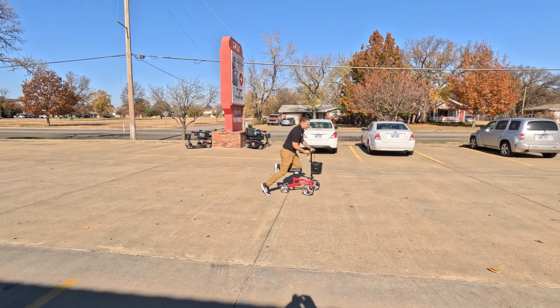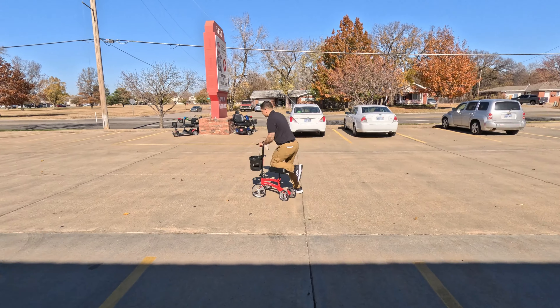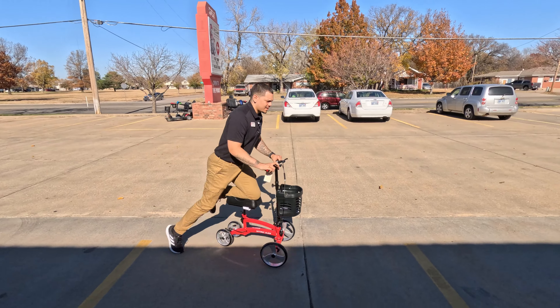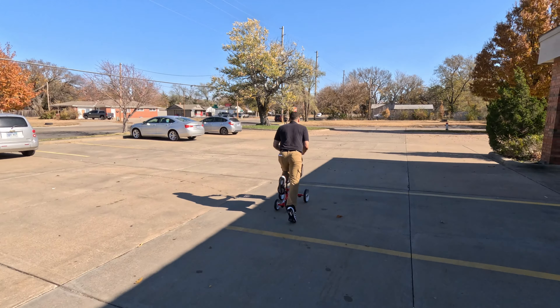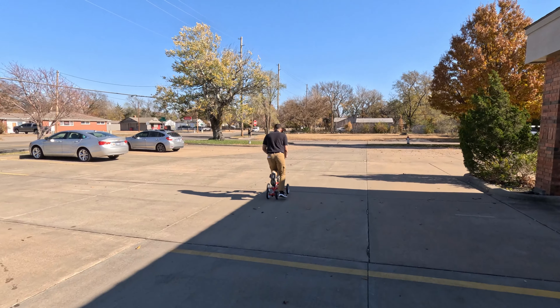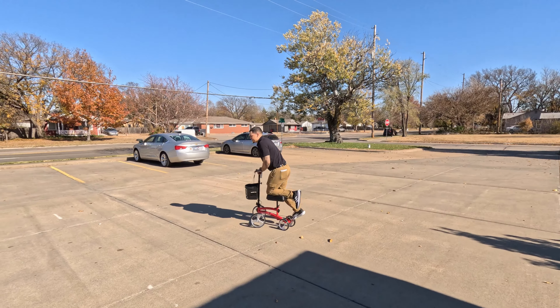We'll go ahead and check the turn radius on this — you can definitely see that. We'll also test out these brakes. You're not going to want to go too fast, but we'll get a little speed to it and just slightly squeeze — it definitely does stop on a dime, so that's a good thing.